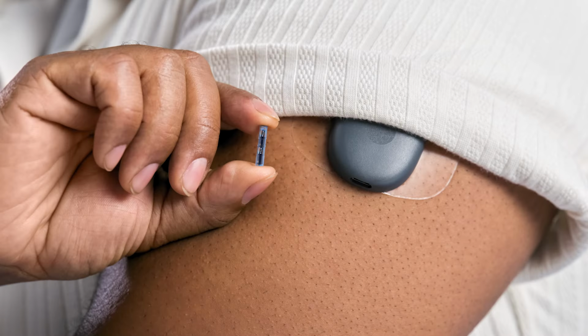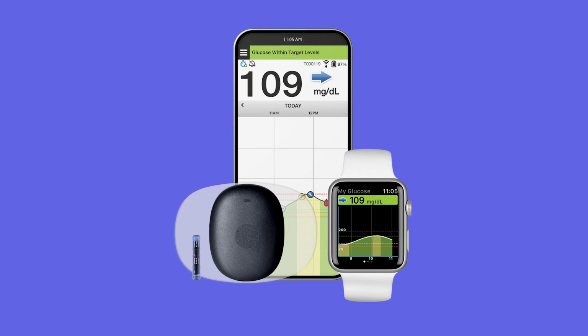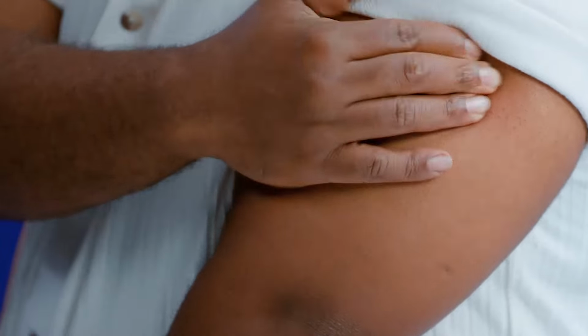For those that are new, Eversense is a sensor about the size of 2 stacked Tic Tacs. It gets placed just under the skin through a short, simple procedure. There's an outer transmitter that powers the implant and sends glucose readings to a smartphone. The transmitter easily comes on and off at the user's discretion, but when you take that off, you won't have readings, and when you put it back on, you don't get retroactive readings either.